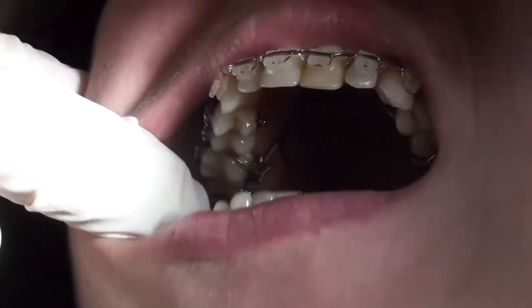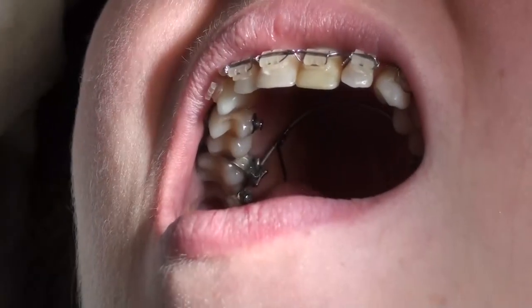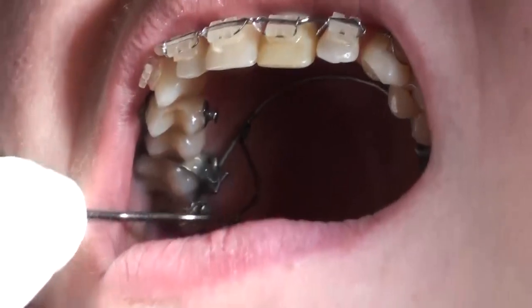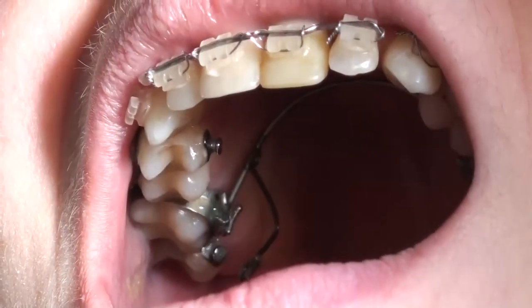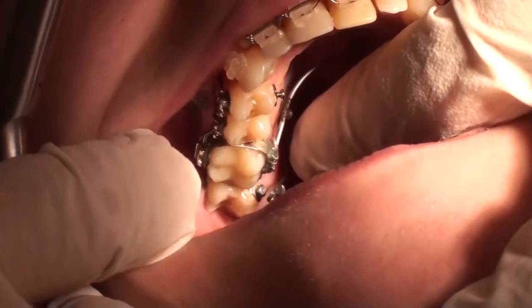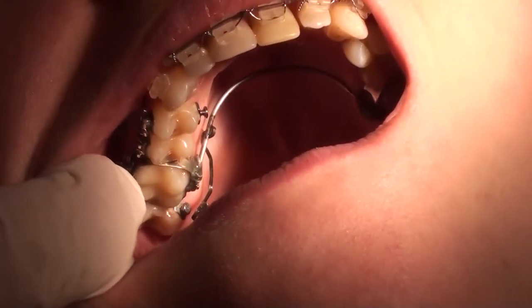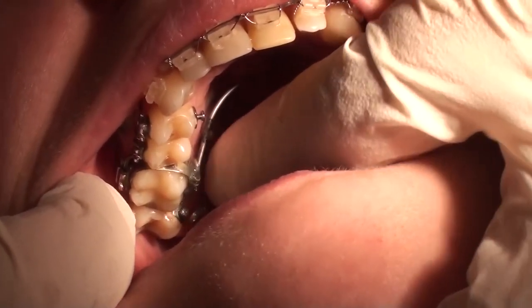Here you can see the residual activation, which is maybe a few millimeters, delivering a very small force that is actually stabilizing the position of the seventh. The seven is quite aligned with the six now — they are all expanded in comparison with the lower, but we decided to expand the lower, so this is more stabilization than anything else.